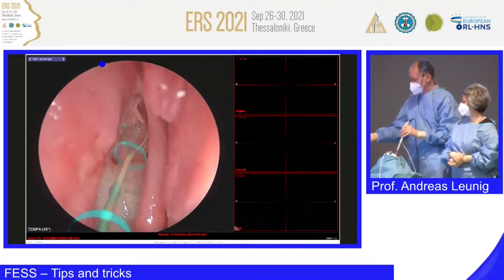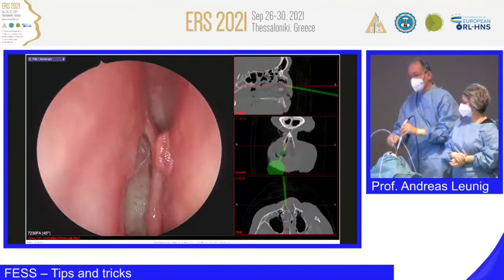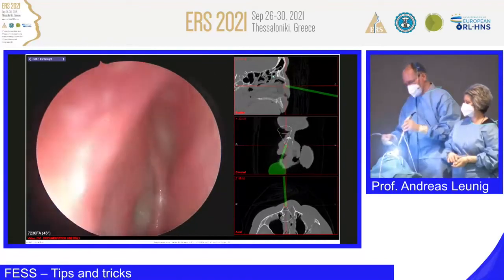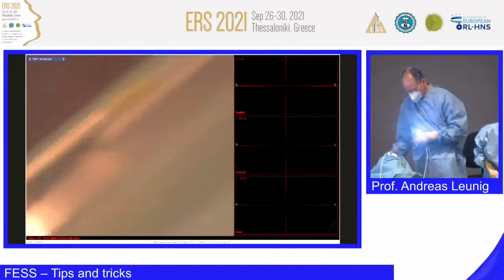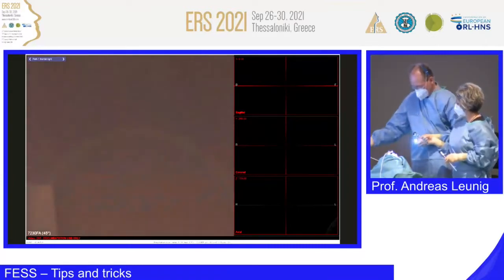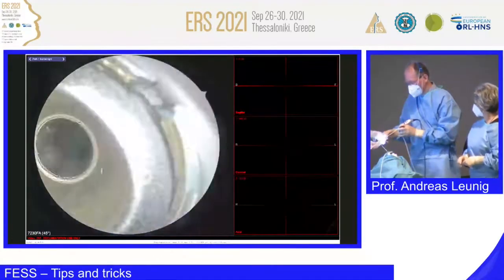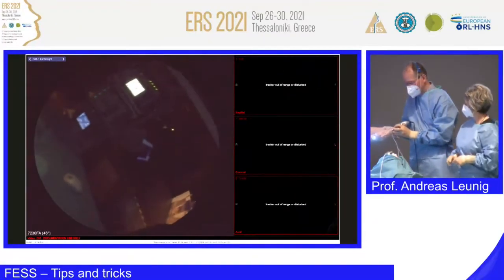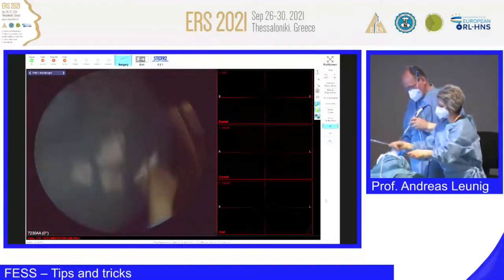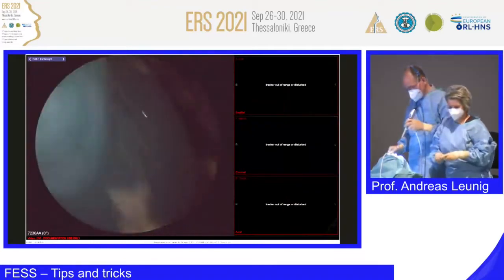So, now, please switch it off. Now, I come back with my 0-degree endoscope. I want to fish out this here. Okay. So, I change to the 0-degree endoscope. Why? Because I would like to resect the ethmoidal bulla, and for this we have to see if there's air in the ethmoidal bulla or not. Sometimes the ethmoidal bulla can be very hard. Yeah. So thank you Katharina and thank you Mrs. Hartmann, they are doing a great job, and without them I wouldn't be able to do it in this way.